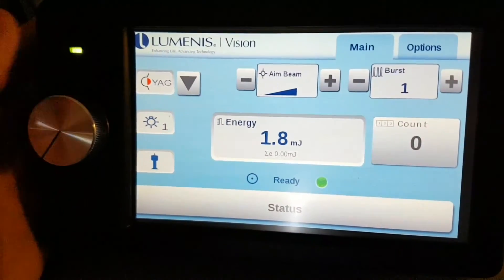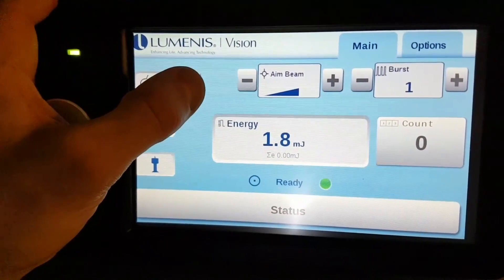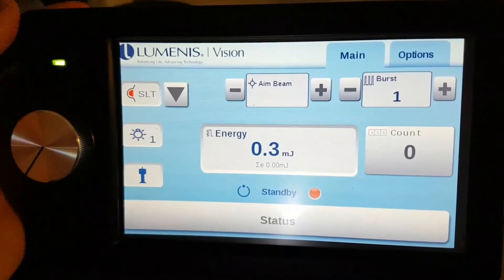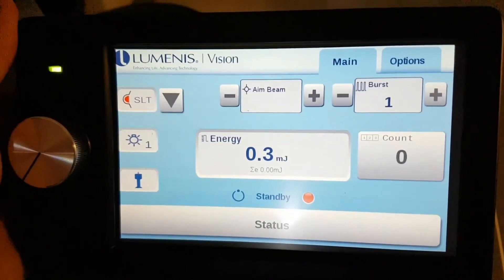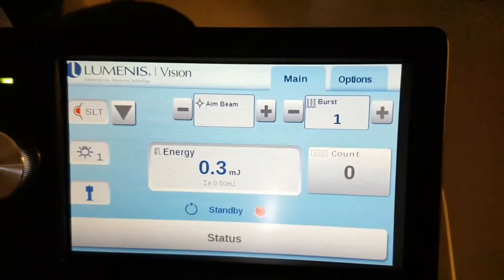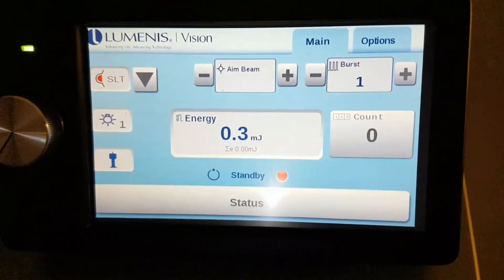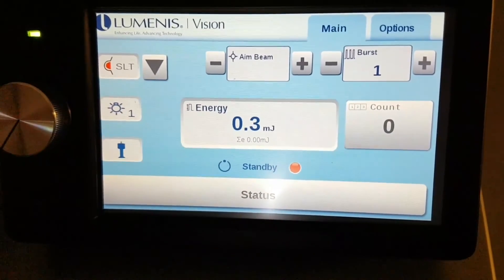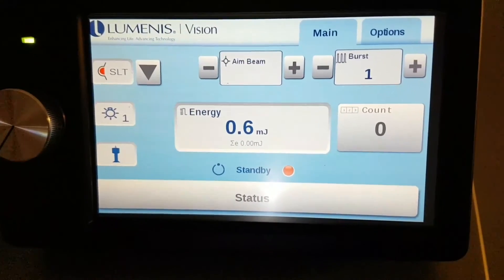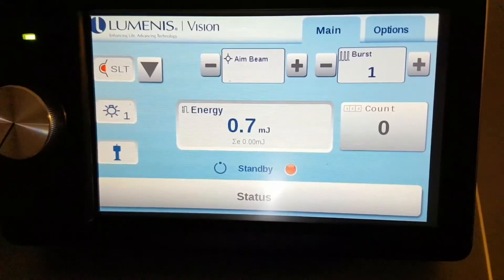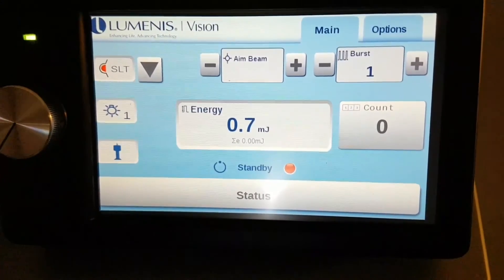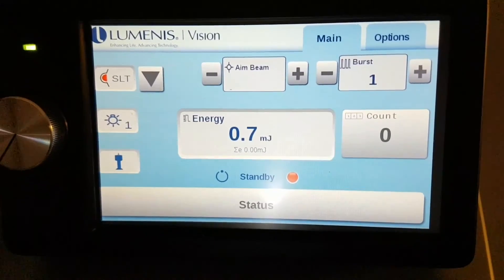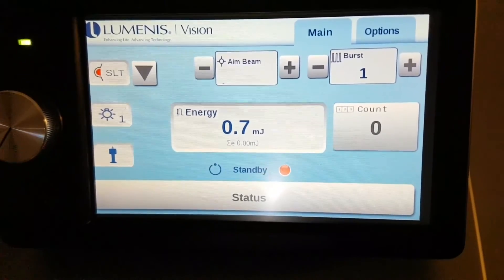If you want to switch from YAG to SLT, just press this button here. And then you're in SLT mode. There are no bursts in SLT mode. It's just a single shot. Usually you start at 0.7 and move your way up until you have champagne bubbles on one out of every two shots.